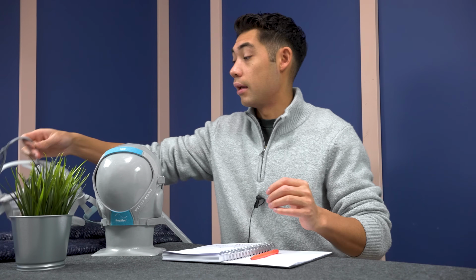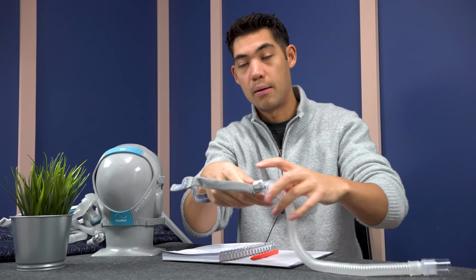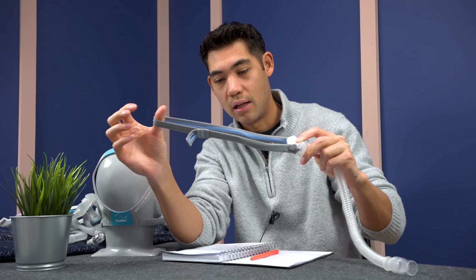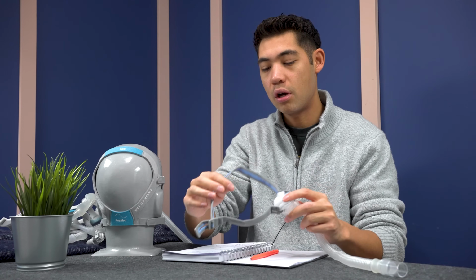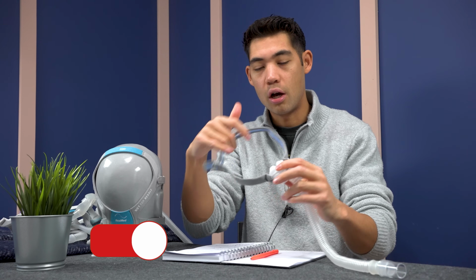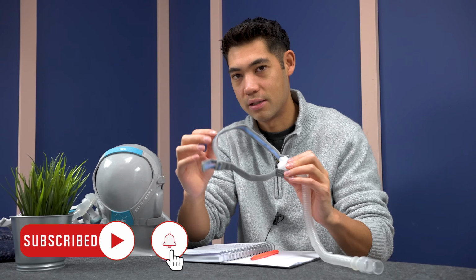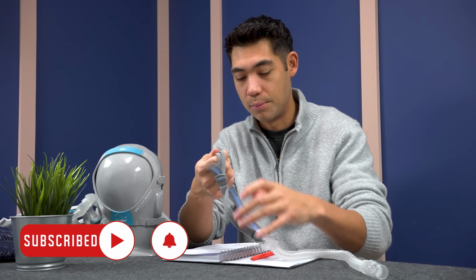Is it good or is it bad? Well, typically it's good, right? Because it's nice and flexible. Here we have a ResMed P10, right, with a nice elastic headgear. However, when we're talking about side sleepers, especially those who toss and turn, because there's not a lot of points of adjustment, I mean, there's really no points of adjustment because of the elasticity, other than this clip here.